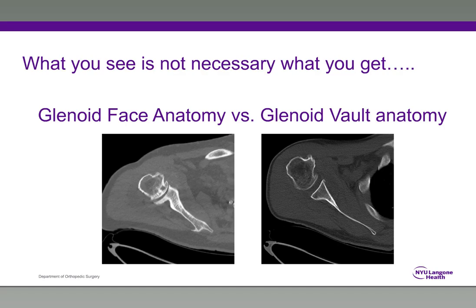And to me, what you see in the glenoid is not necessarily what you get. There's a concept of face anatomy versus vault anatomy.